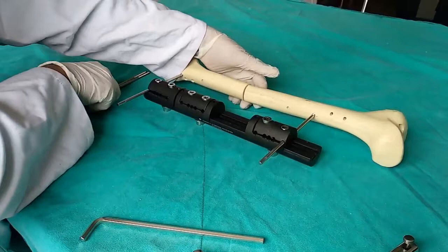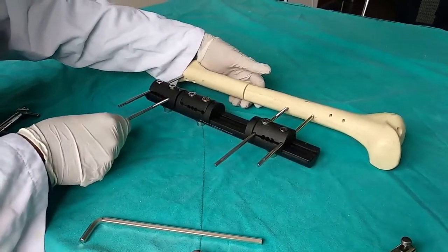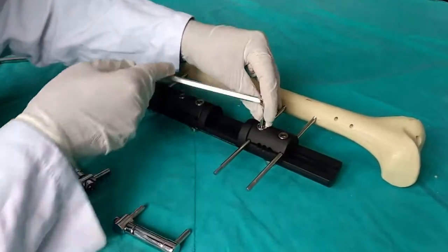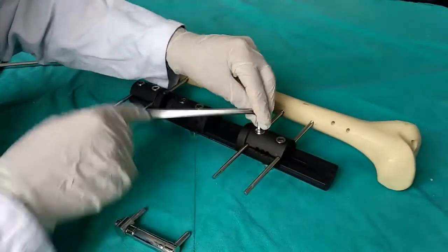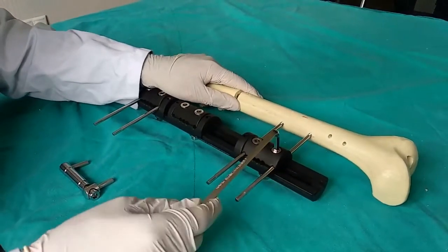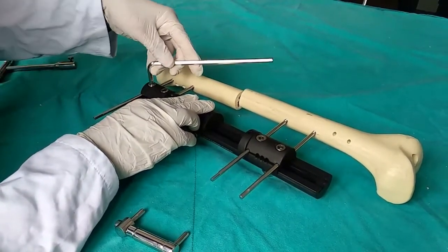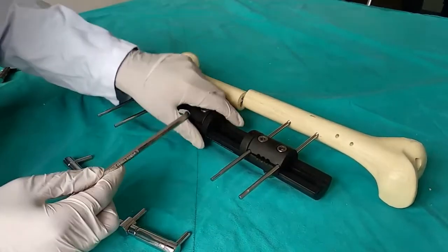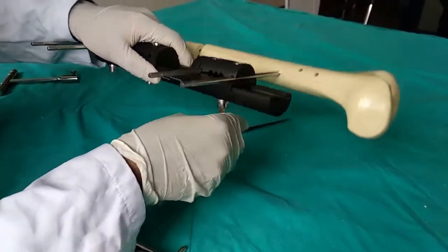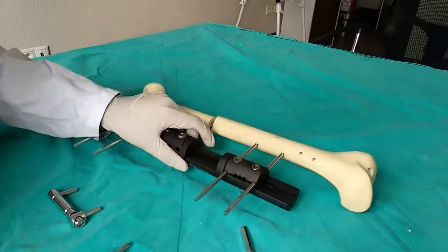Once the second shanz screw is inserted, we similarly secure the clamp without fully tightening it, making sure there is no loose space. The alignment of the last two shanz screws provides alignment for the bone. We then add the supporting shanz screws from both the lower and upper sides. Once all shanz screws are inserted, we tighten the clamps, ensuring no movement remains but not overtightening in case adjustments are needed later.